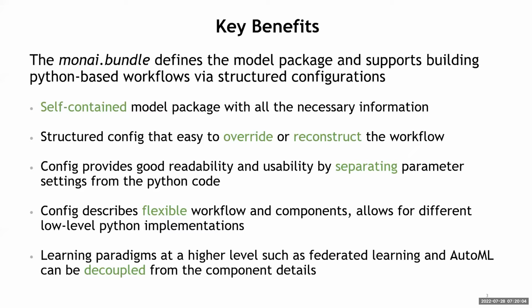The idea with these workflows is that the MONAI system can invoke these as if they were running programs and be able to construct a large set of objects that then represent your training environment, for example, or your inference environment. And so you can include with these JSON files a generic way of actually using this model and including the code to use this model in other contexts and for other users. Configuration provides, again, the readability and the usability for what these actual workflows are going to do, but separates them out from the Python code directly.